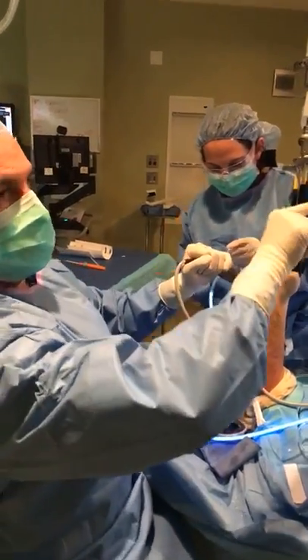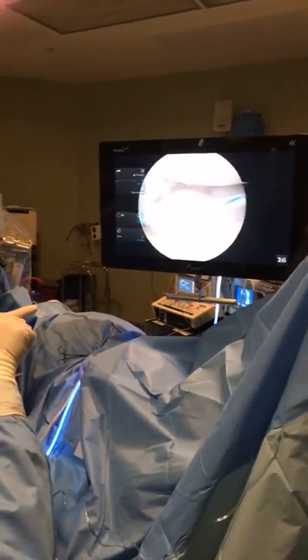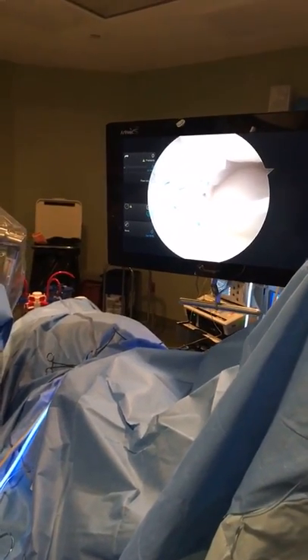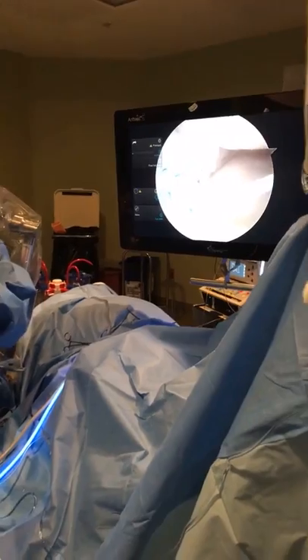So what you're seeing here is a knot pusher I'm loading onto the suture, and I'm gonna push that down, and I'm gonna cinch it down, and I'm gonna basically restore the trampoline.